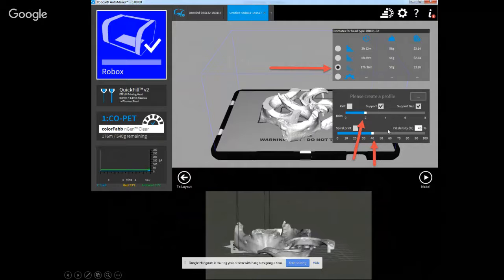So now that we have all this information, we have the angulation of our implants, we have the depth of our implants based on the bone reduction guide and the surgical guides worked up in Blue Sky Bio Plan. We have everything worked up from a prosthetic standpoint on how much bone we have to reduce to get 17 millimeters of clearance for a final prosthesis that's going to be fixed.